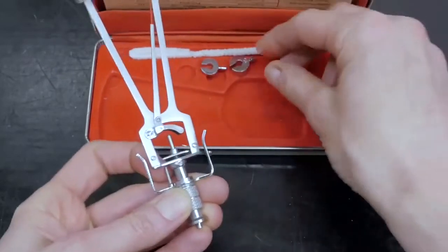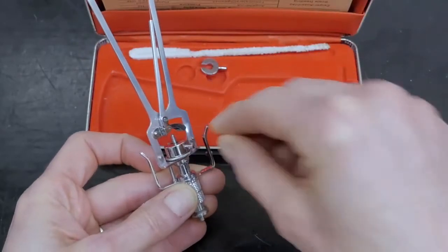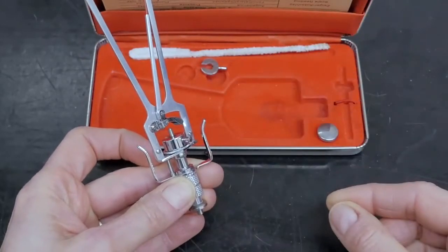The additional weights provided allow for total weights of 7.5 and 10 grams. These weights are added to the top of the 5.5 gram weight only when high intraocular pressures are measured, as they will increase the accuracy of the measurement when the intraocular pressure is greater than 30 millimeters of mercury.